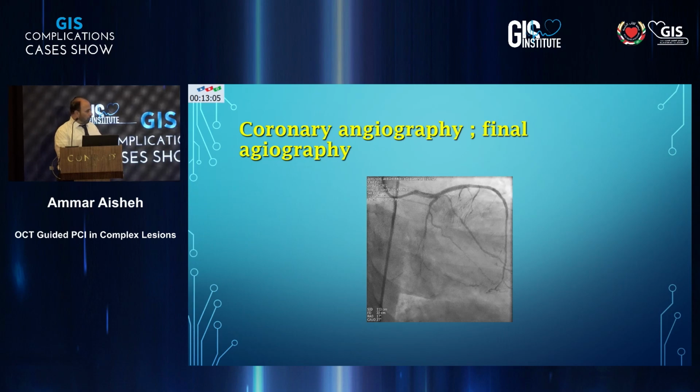But with the thrombus, because it absorbs all the light, you cannot see beyond the thrombus.